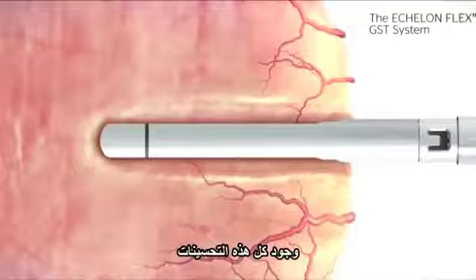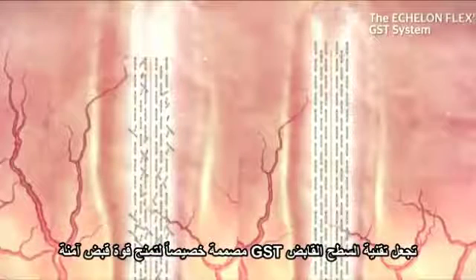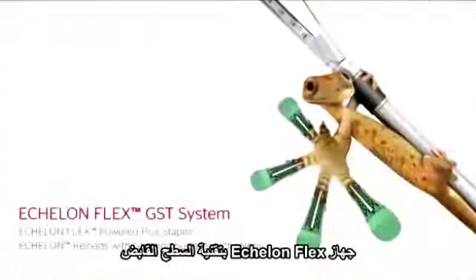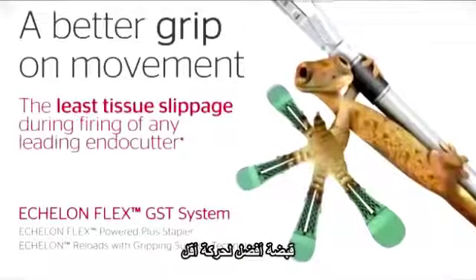The combination of these improvements makes the GST system uniquely designed to deliver better gripping power, to provide the least slippage during firing of any leading endo cutter. Less tissue slippage results in unsurpassed stapling performance. The Echelon Flex GST system — a better grip on movement.